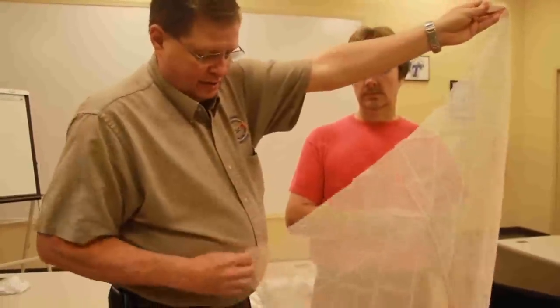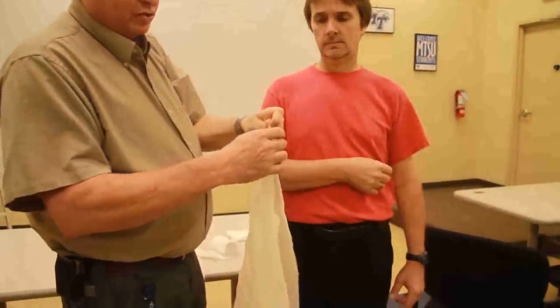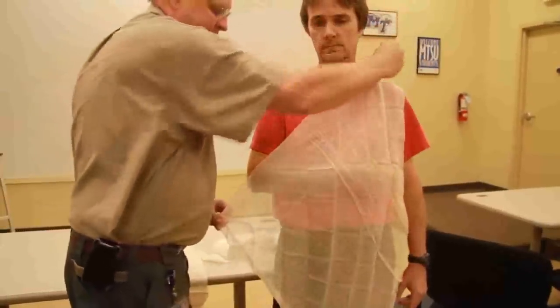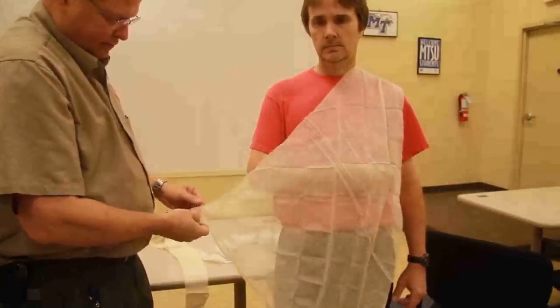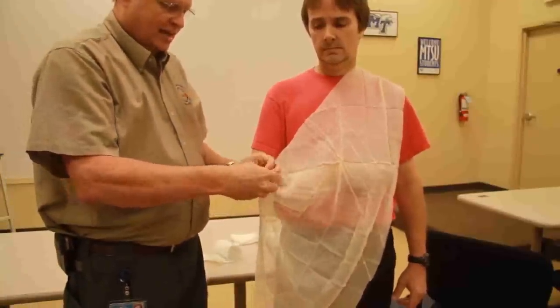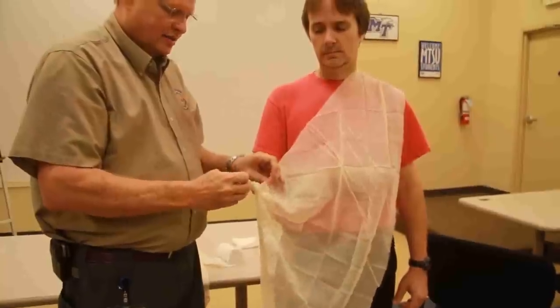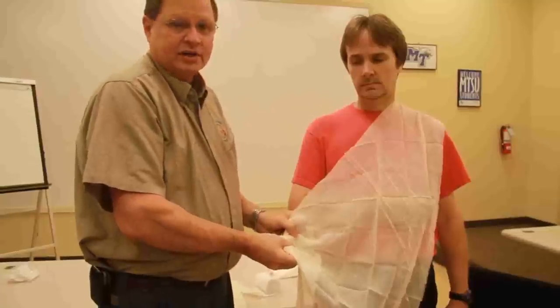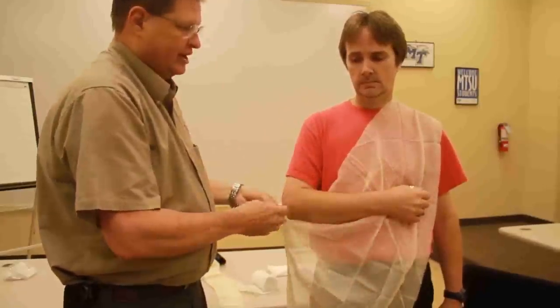The apex of the triangle will actually go toward the injured extremity. So when I lay this out, it's going to go over like this, pointing toward the injured arm. The next thing I'm going to do is I'm going to tie a pigtail, which is nothing more than an overhand knot, into my triangular bandage. And that gives me a cup for my elbow to sit in. Now we're going to put the triangular bandage on with the elbow sitting in the cup.